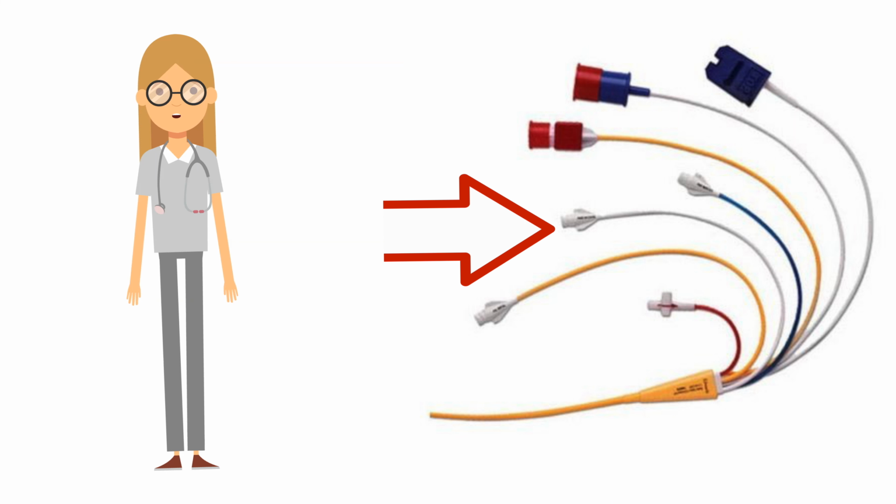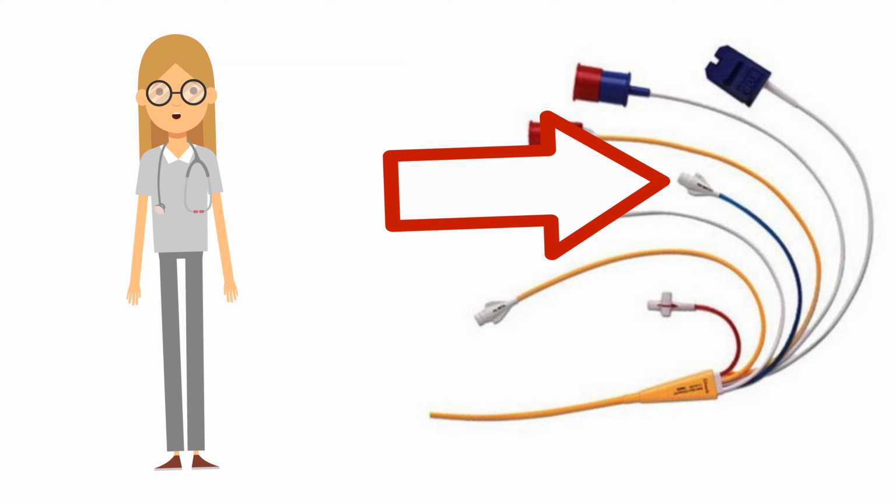It is used for administration of IV fluids or venous blood sampling. The blue port is the proximal injectable port located in the right atrium and is used for CVP monitoring. IV fluid may also be administered through this lumen and venous blood samples may be obtained.